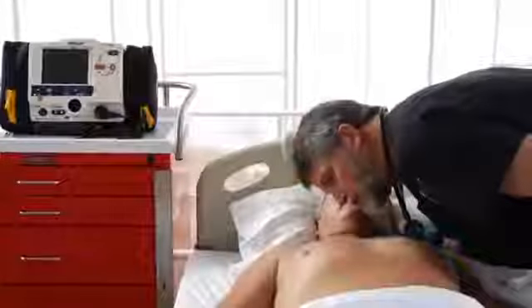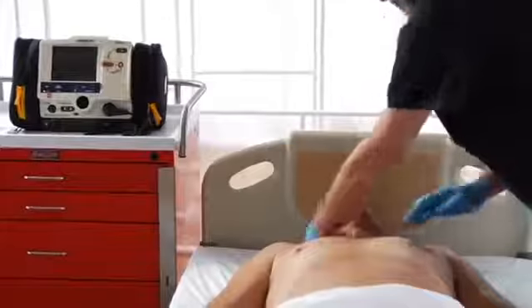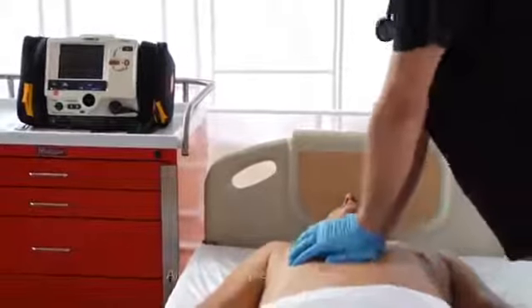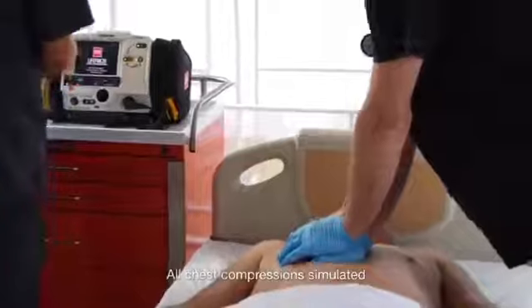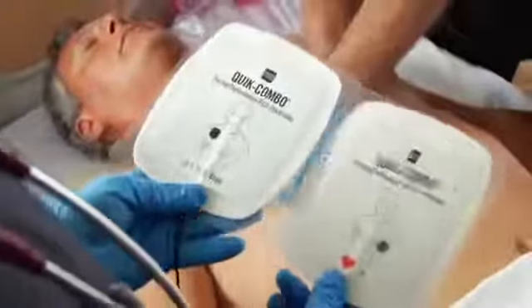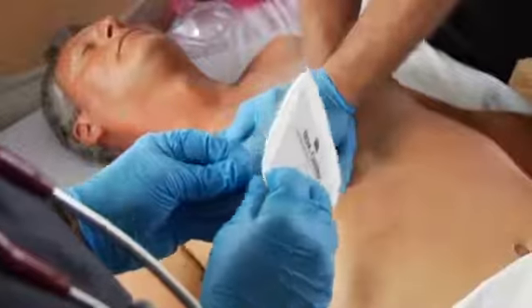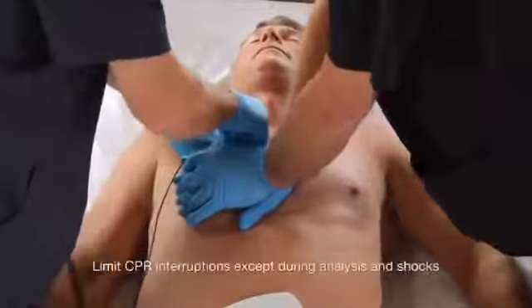So, let's begin. You have an unresponsive patient. Verify the patient is not breathing normally and has no pulse or other signs of circulation. Turn on the defibrillator, bare the chest, prep the skin if necessary. Place the electrodes in the anterior lateral position as shown in the picture on the back of the electrodes. Make sure the electrodes do not touch each other, lead wires, ECG electrodes, dressings, or medication patches.